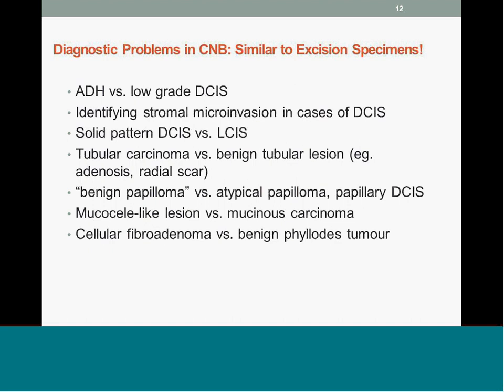Benign papilloma, in quotes, because this is terminology that I personally hate. Papilloma to me is by definition benign and doesn't need to be otherwise qualified, but there it is. It's understood by people and it's in the lexicon. Mucocele-like lesion, we'll talk about that, and similarly fibroadenoma versus benign phyllodes tumor.